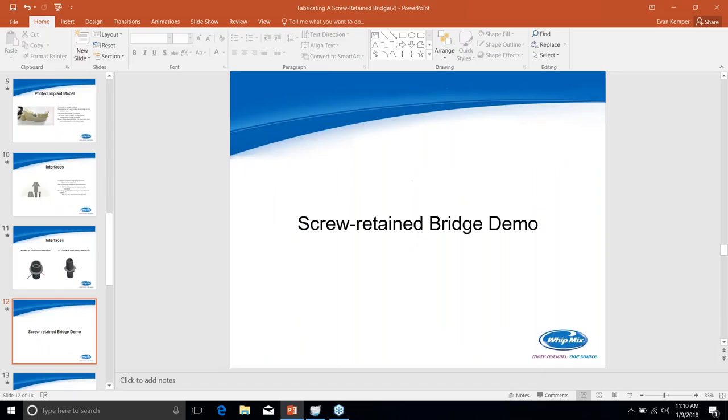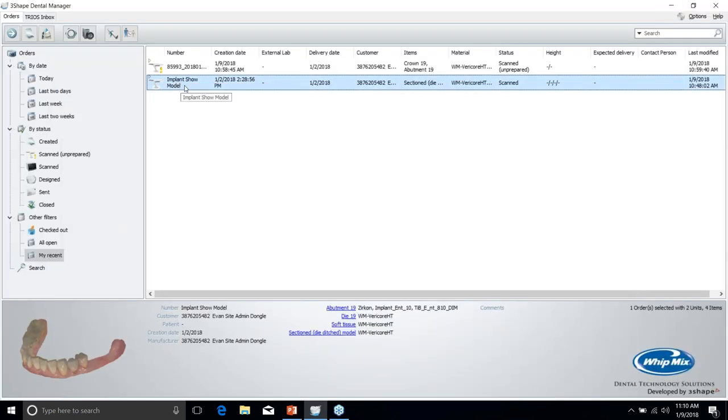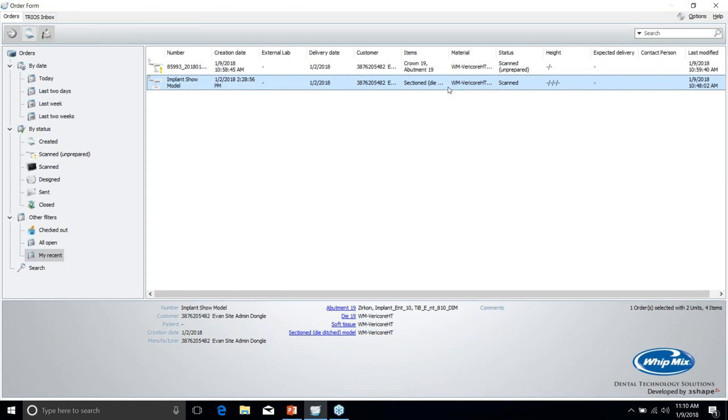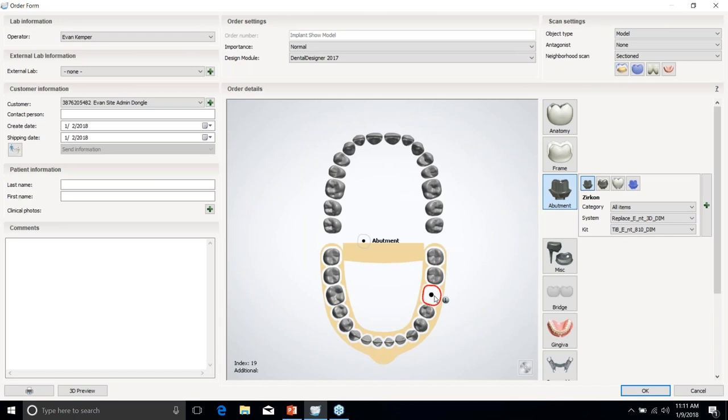So now we'll look at not a bridge, but a single unit. So in 3Shape, the one thing I'm not going to show you is scanning, but the scanning is pretty straightforward. You just screw in the scan body when it asks you, and it'll pick up the position. As far as setting up the order in 3Shape, you'll pick your tooth, and then under abutment, if you click screw retained crown, this will be a full contour zirconia screw retained crown on a tie base.